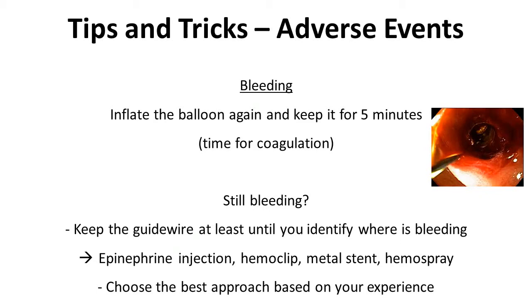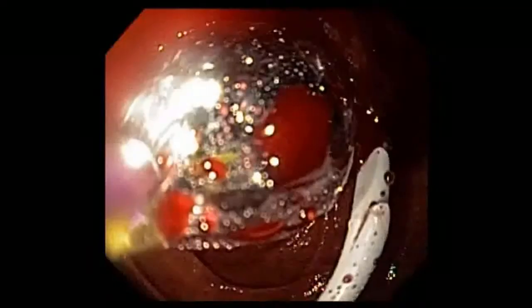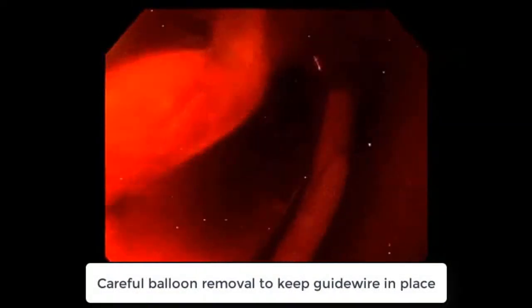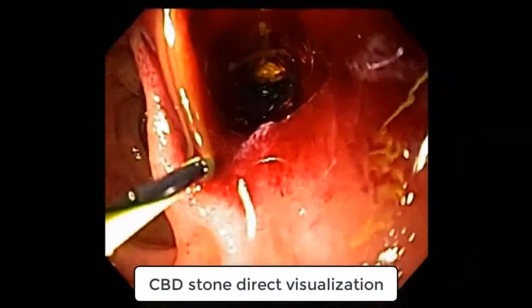When the balloon is deflated again and if bleeding is still occurring, you should keep the guidewire in place at least until the bleeding site is identified. Then, an endoscopic hemostatic approach can be performed based on local experience. In our case, after deflation of the balloon for the second time, no active bleeding was observed.